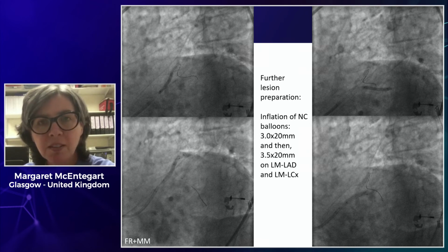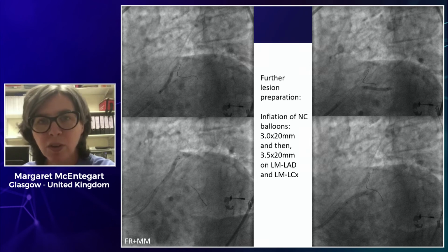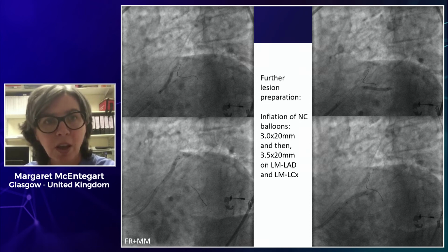But in some sense, there's almost a need to modify the vessel adequately to allow you to get a good stent outcome. So it's a balance between the risk of the modification versus the ultimate outcome of the stent. You have to make those decisions step by step during the case, constantly weighing up the risk-benefit balance of every decision you make in this type of situation.